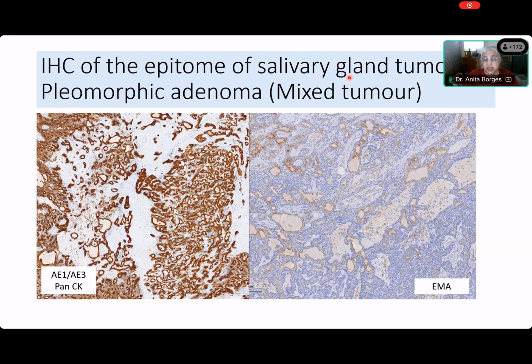They are forming tubules now. They are tubules. Excellent. And what kind of tubules? They are tubules with a double layer. Can you see that? So they've got a lumen and they have got cells that are surrounding that lumen. And outside the cells, you see that there is a myxoid matrix.